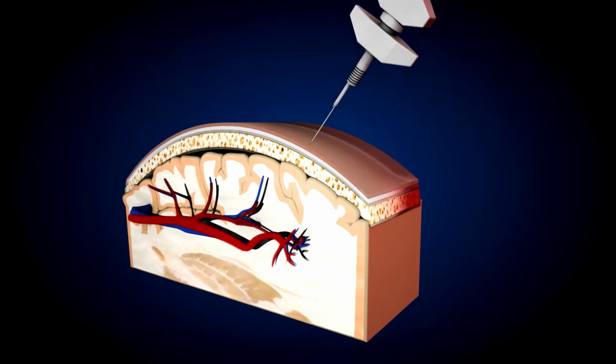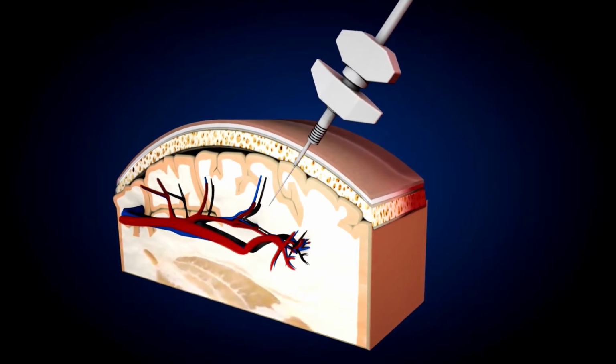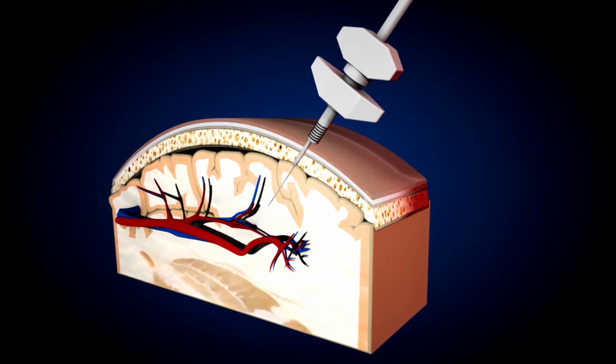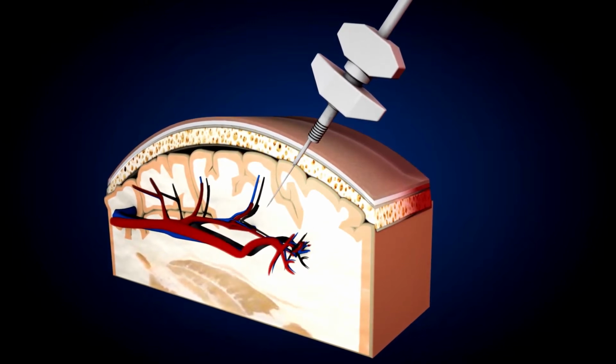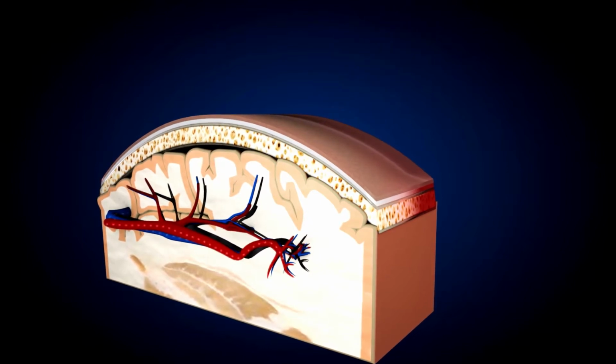So the purest way to monitor the adequacy of cerebral oxygen delivery would be to measure cerebral tissue PO2, which is done in traumatic brain injury but is not used in newborns for a variety of reasons. Relying on the SVO2 of cerebral venous blood is the next best surrogate, but requires repeated phlebotomy and has other challenges. So many centers frequently rely on cerebral near-infrared spectroscopy as a surrogate to identify patients with low SVC saturations.